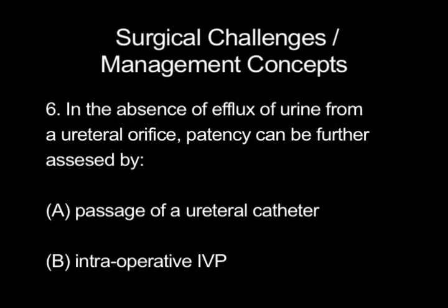In the event there is an absence of efflux of urine from a ureteral orifice or sluggish efflux of urine, patency can be further assessed by either passage of a ureteral catheter or intraoperative intravenous pyelogram.